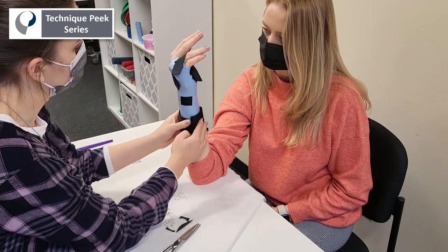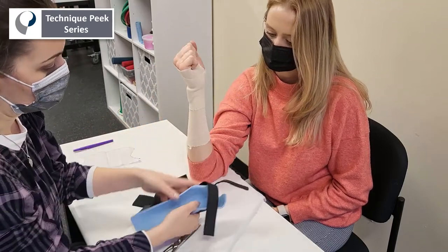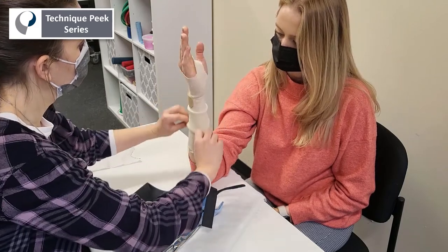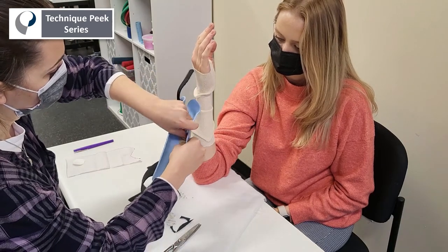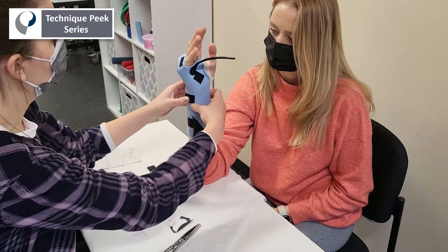Here I'm just showing it's a similar strap for the bottom — we just ran out of material in this case. And lastly, we're going to repurpose that pad in the space we created at the ulnar styloid, using the pad we've already placed on the patient. Place it on the inside of the splint, and then you can prevent that skin irritation.